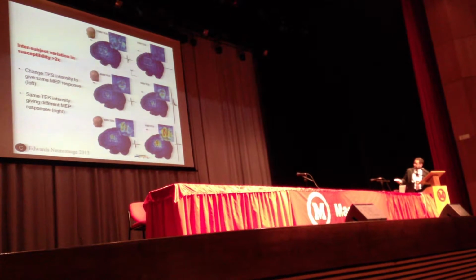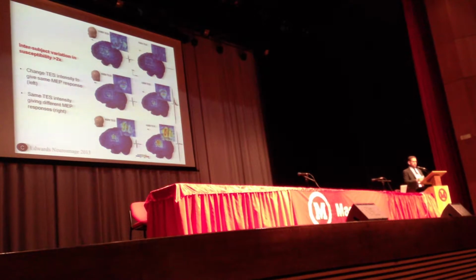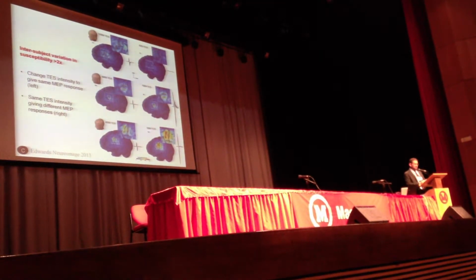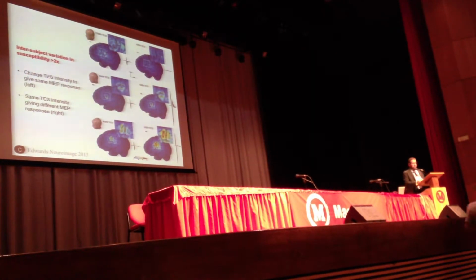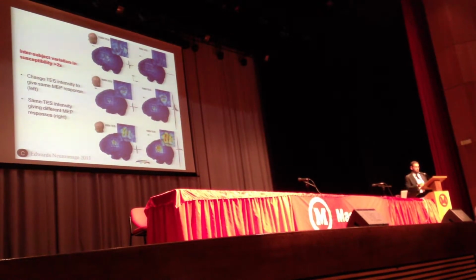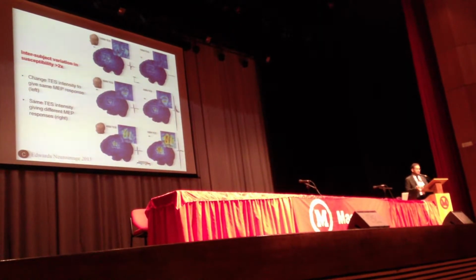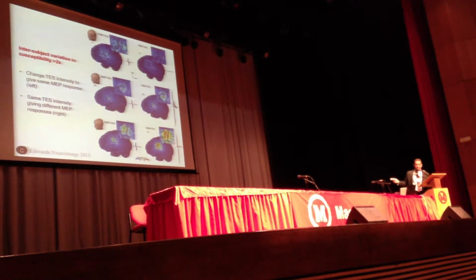We did 2 experiments. And let me start with the one on the right. In the one on the right, we applied the same dose to everyone. So everyone received 600 volts. I received a 600 volt shock. Dr. Edwards received a 600 volt shock. And we measured the MEP that would be produced for each one of us. Well, it turned out that in my case, 600 volts did not produce any MEP. It was not strong enough. Higher intensities could, but not 600 volts. But 600 volts could produce a very strong MEP in Dr. Edwards and in the other subject.